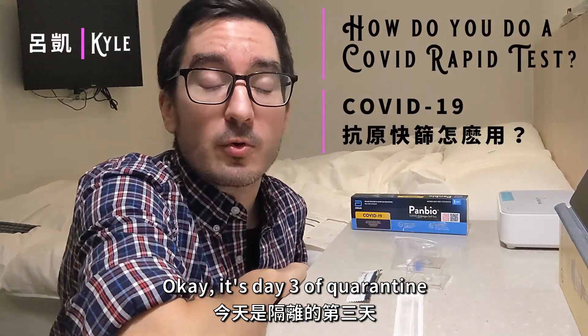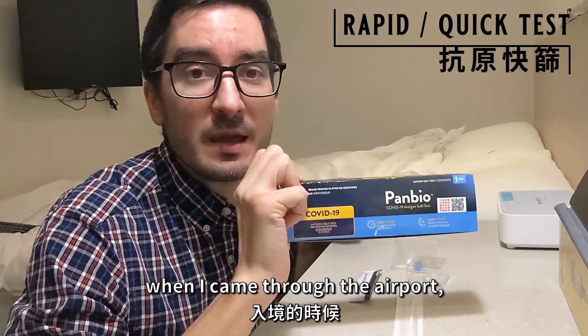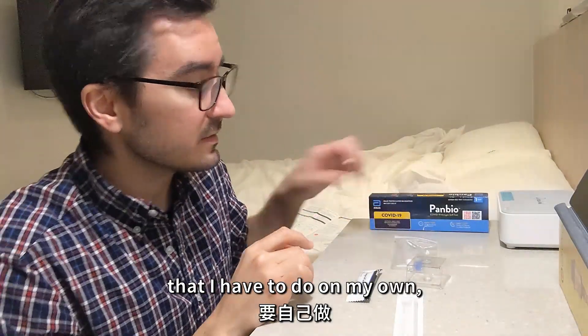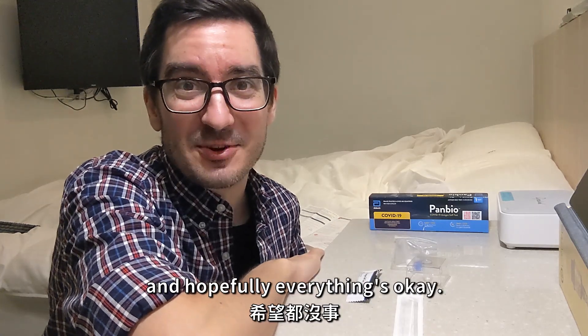It's day three of quarantine and today I need to take a quick test. So when I came through the airport, they gave me three of these that I have to do on my own and then tell them if I'm sick or not. Hopefully everything's okay.